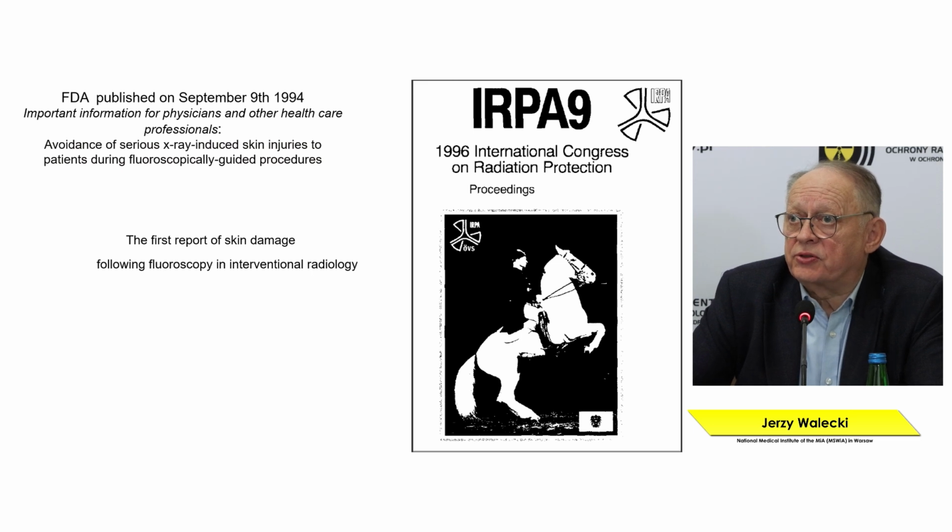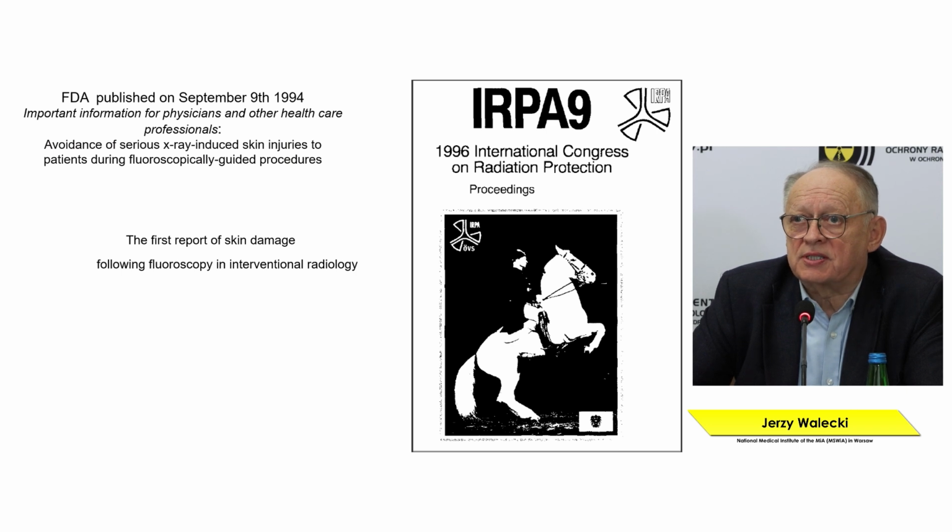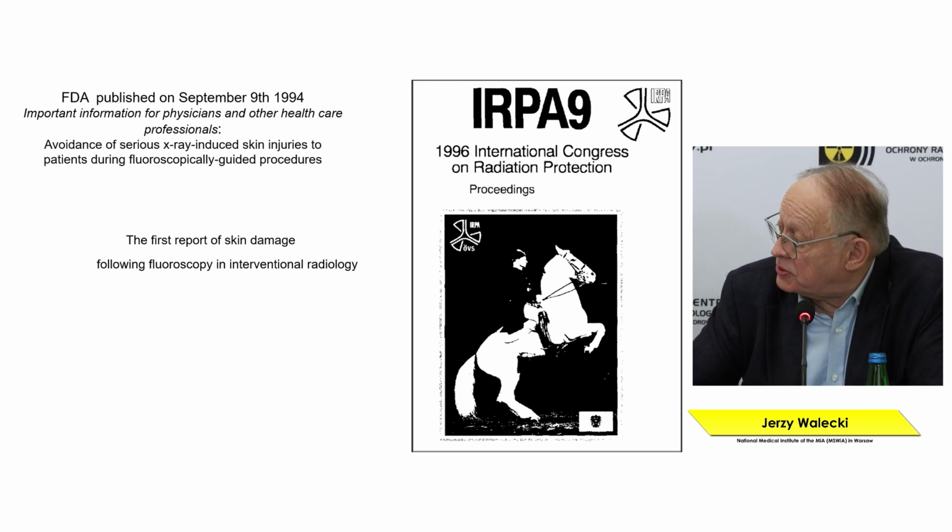In 1996, at the International Congress of Radiation Protection in Vienna, that was the first report speaking about the consequences of fluoroscopy in interventional radiology. Well, that related mainly to skin injuries.